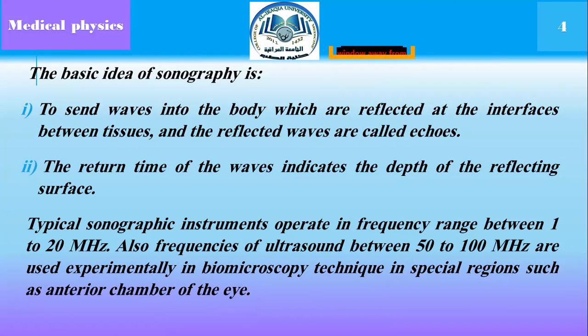Also, frequencies of ultrasound between 50 to 100 megahertz are used experimentally in biomicroscopy technique in special regions such as the anterior chamber of the eye.